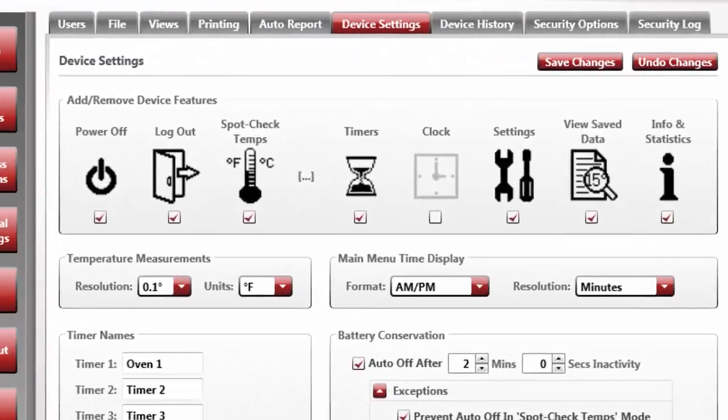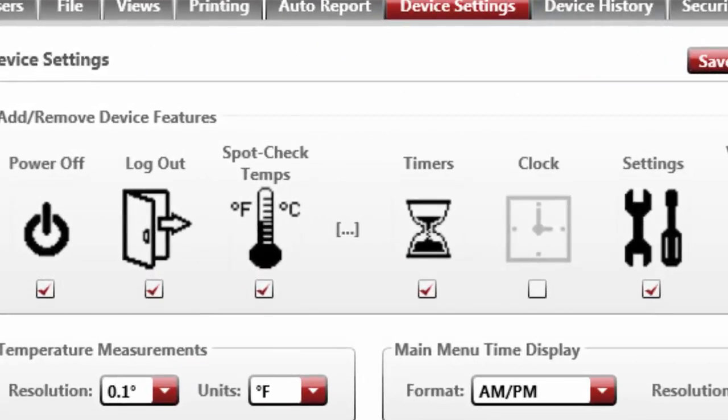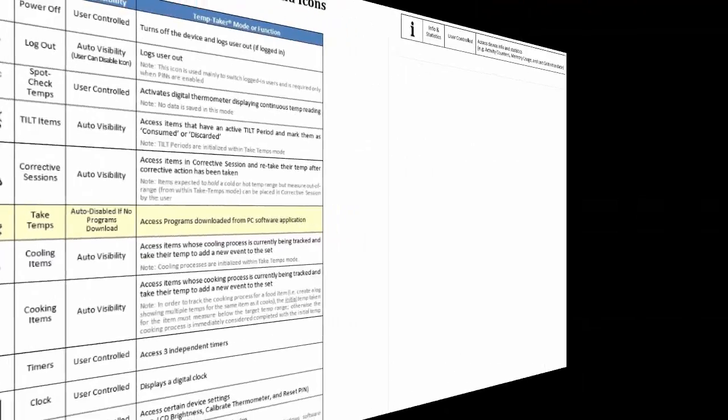There is a bracketed section between the Spot Check Temps and Timers icons. This represents a placeholder for icons that have now been automated in all Temptaker software versions 3.5.75 and later. This means that these icons are no longer visible to a user unless activated through a temperature-based program within the handheld unit.